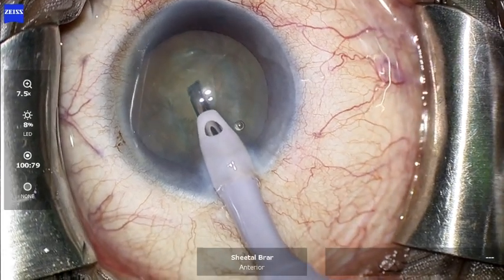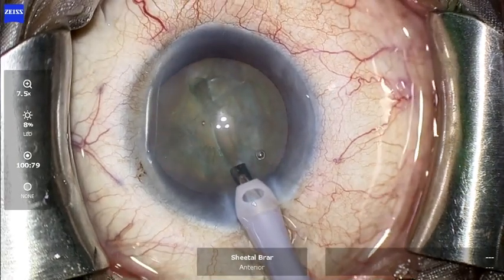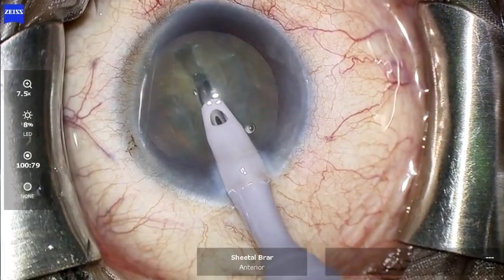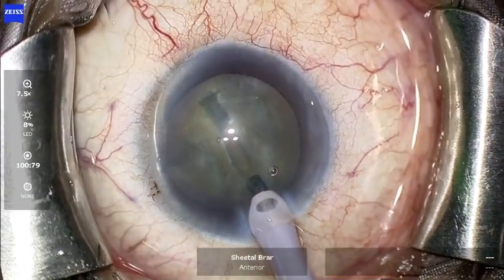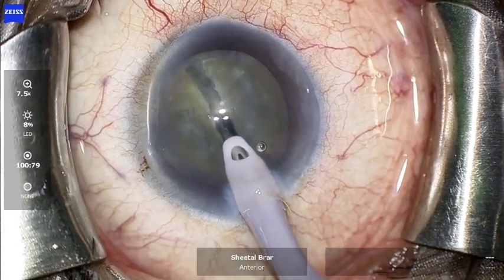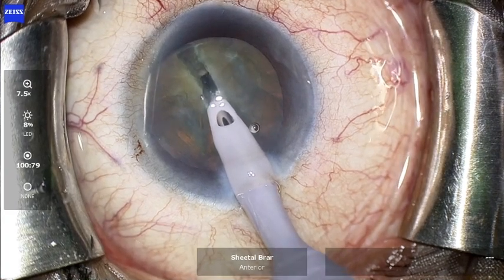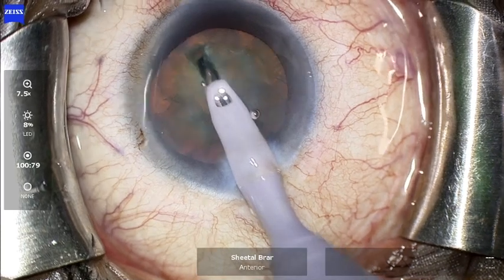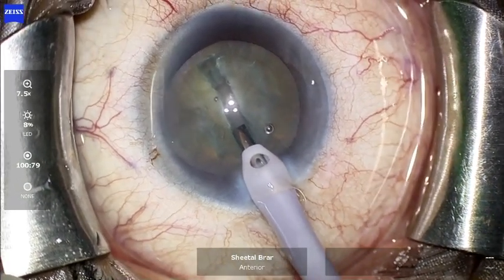While keeping the bevel up, one should start the sculpting movements from the proximal end of the CCC towards the distal end. Knowing that the thickness of the cataractous lens may vary anywhere from 4.5 to 5.5 millimeters in the center, and the outer diameter of the phaco tip is 1.2 millimeters, one can safely take two to three complete edge-to-edge passes of the tip.